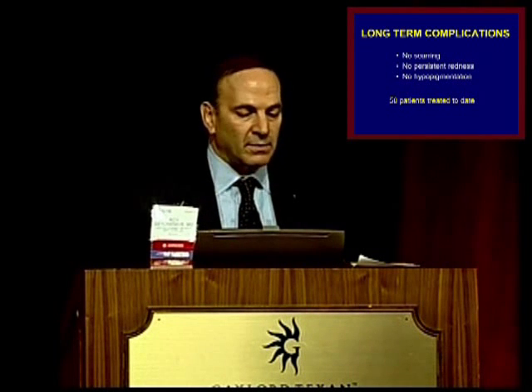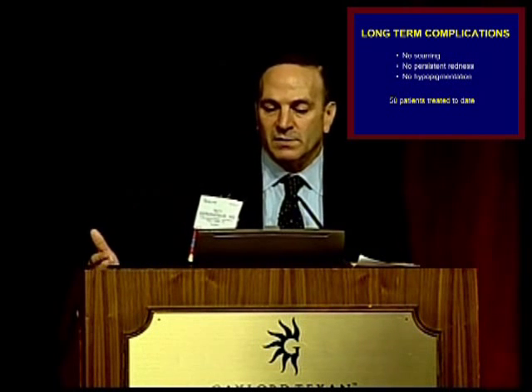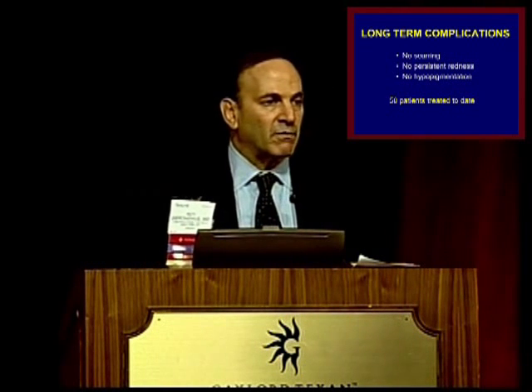We've not had any scarring. We've not had persistent redness. I'm talking about something that lasts for months. And I think most importantly, we've not had hypopigmentation. This was one of the big problems with traditional CO2 laser resurfacing, in that when these patients would come back, they'd have their upper lip done, and it looked like that I Got Milk commercial. You know, you see the white upper lip, and the rest of the skin looks normal. And you can see those patients a mile away. You can tell they had a peel, they had laser resurfacing, they had dermabrasion. That's not happening here, and to me, that's big.